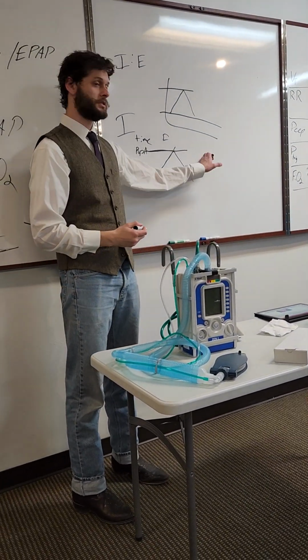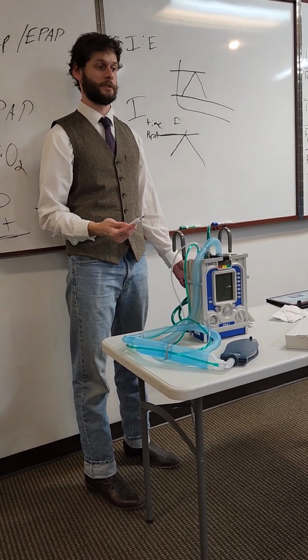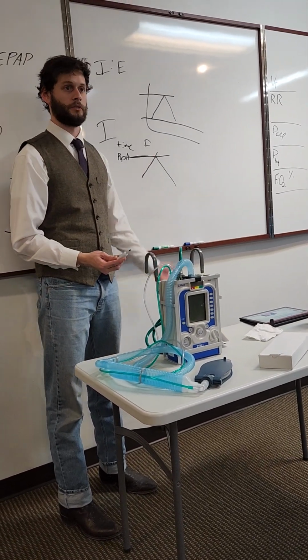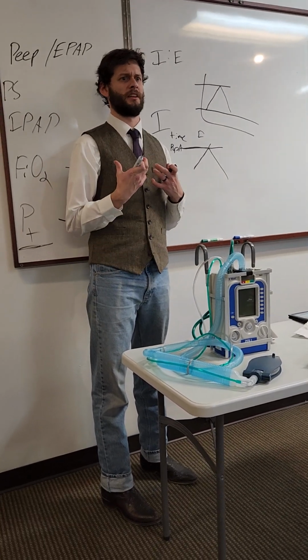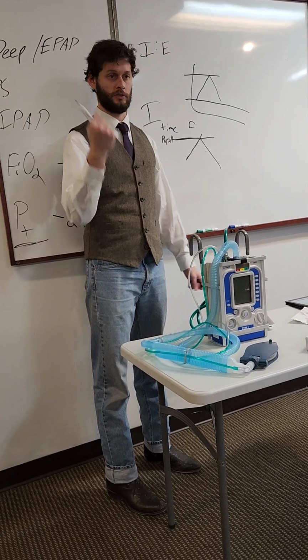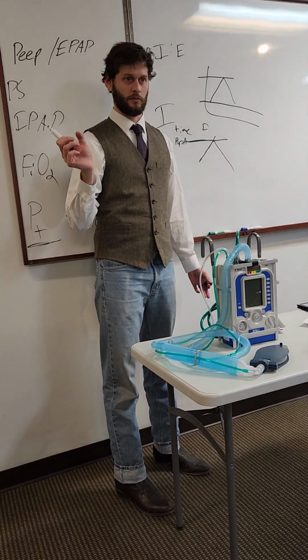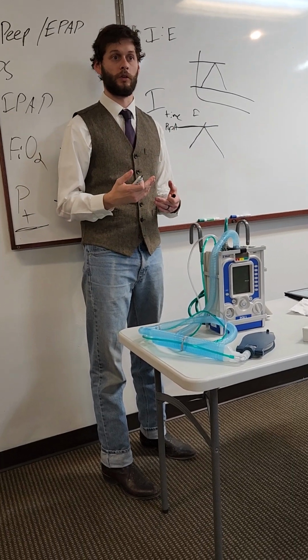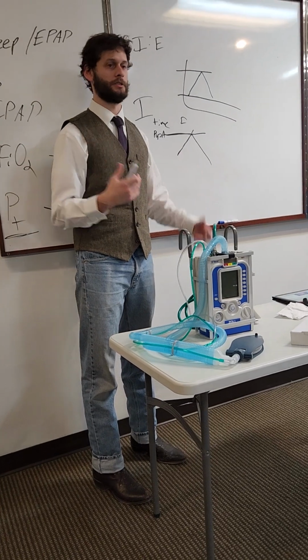Either you set your alarm wrong, or the airway pressure is higher than it should be for some reason, maybe they've got emphysema, COPD, something like that. Or you need to correct a possible obstruction, right? It could be a mucus plug, or just a lot of mucus in that airway. You look at some of the trach patients, and it's constantly coming out, and you have to suction for 5 minutes, sucking and letting it breathe, and suck real quick, trying to get more out so there's more airway moving through. Or you may need to give albuterol, something like that, to open up those airway passages.